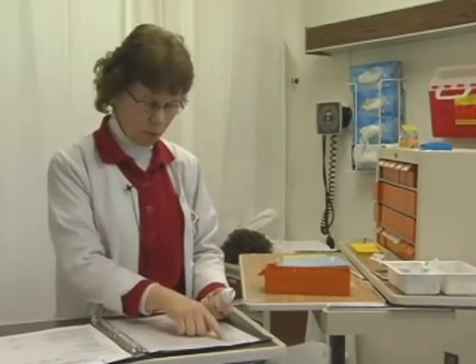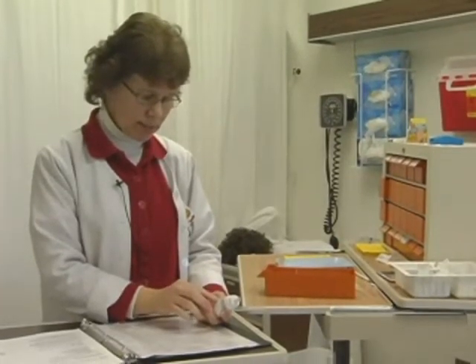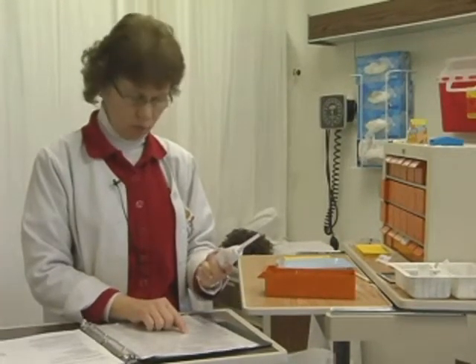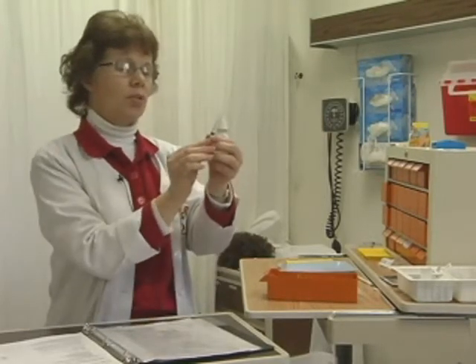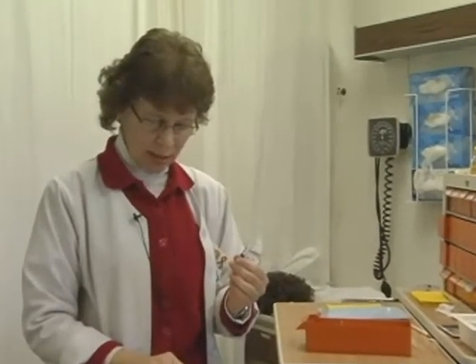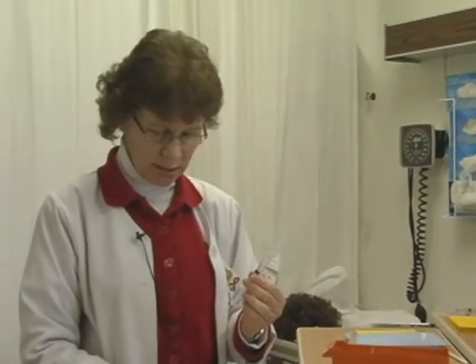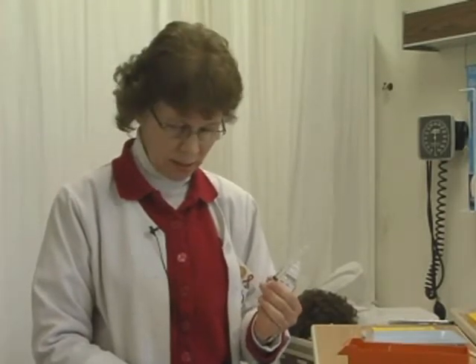So I'm going to do my second check. I have Harmon Wagner, ID 47672. Medication is Zofran. I have Zofran. The dose is 4 milligrams. I have 2 milligrams per ml. As per my calculation, I need 2 ml. And in my syringe, I have 2 ml. The route is IV push, and I have an IV adapter here, a needleless adapter. It's due every 4 hours as needed for nauseousness, and it was last given at midnight. It's been 4 hours since midnight because it's 8 a.m., and so this is safe to give.